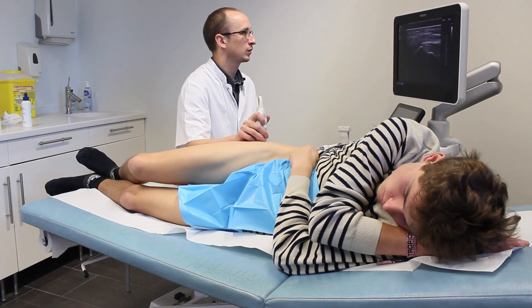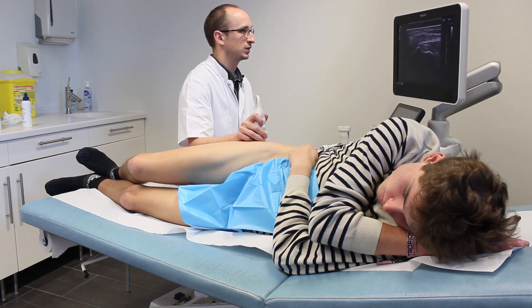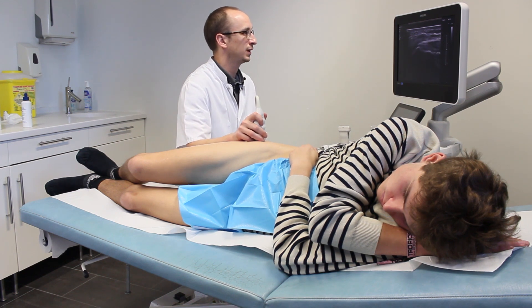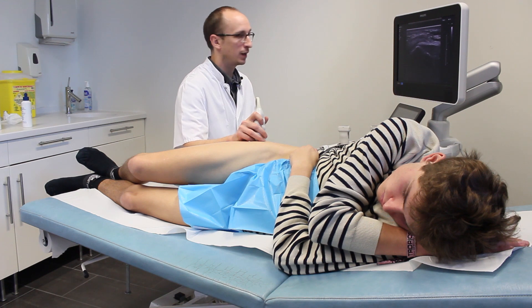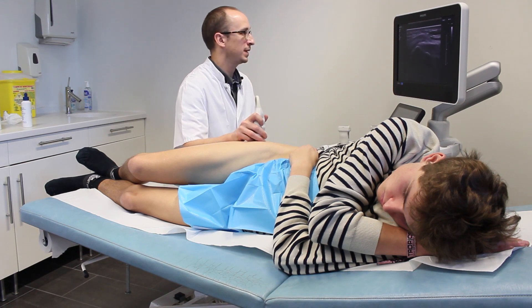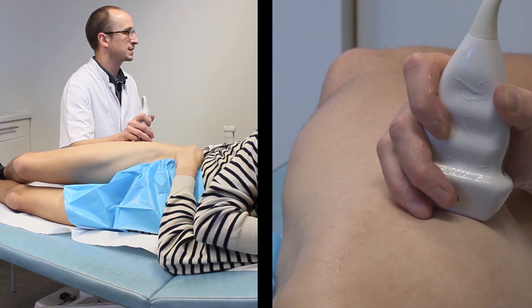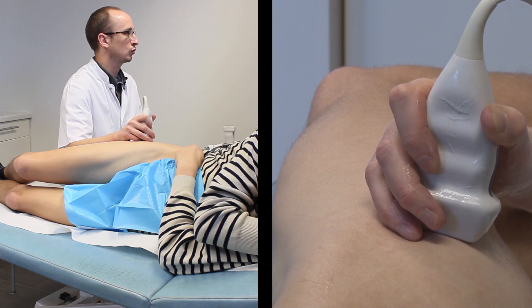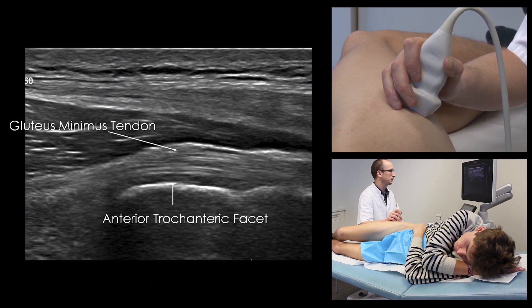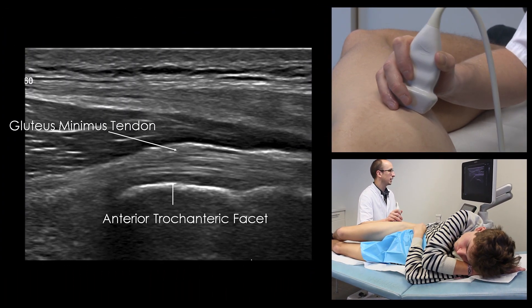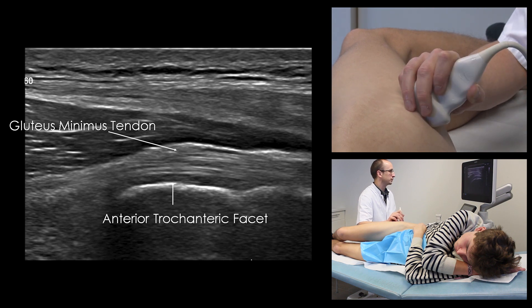The exploration of the gluteal tendons is performed with the patient placed in lateral decubitus position. The greater trochanter is palpated. A superficial probe is placed in an axial position at its level. The three trochanteric facets — anterior, lateral, and posterior superior — are identified.